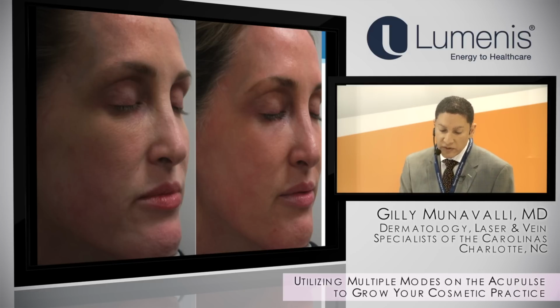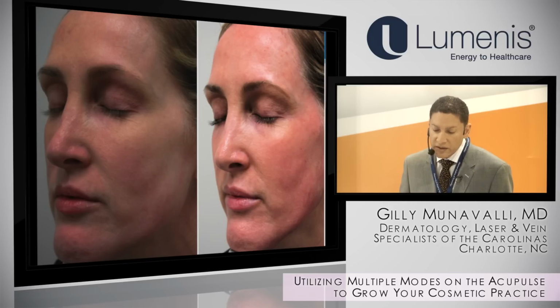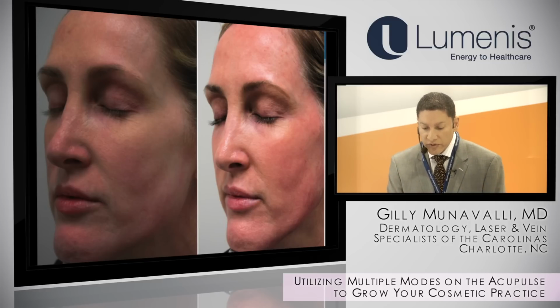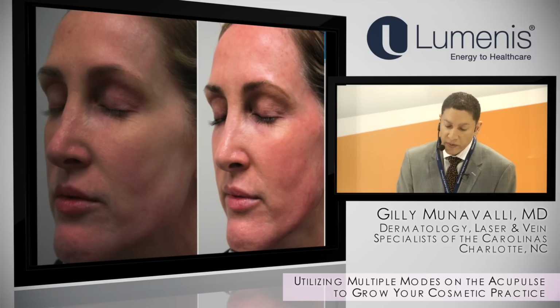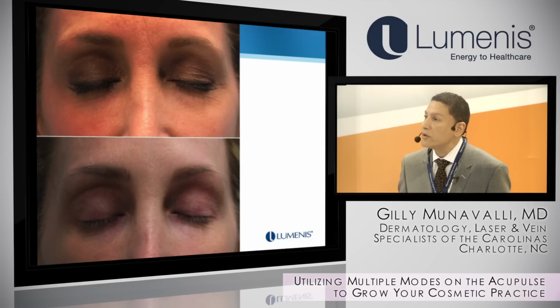This was another patient of ours. You see, she still has a little bit of erythema, but a lot of nice blending. Skin texture is much improved. These are the kind of patients that I'll switch to the feather touch mode. Again, she's still got a little bit of erythema, but you can see the nice soft texture, especially around the eyes and mouth. And this is with a single treatment, single pass.